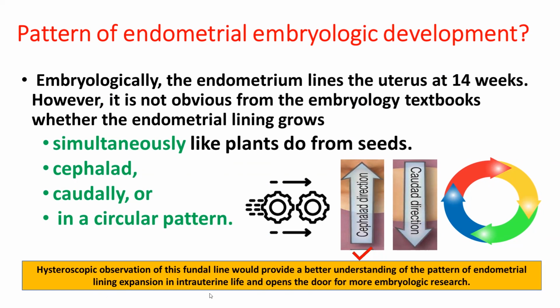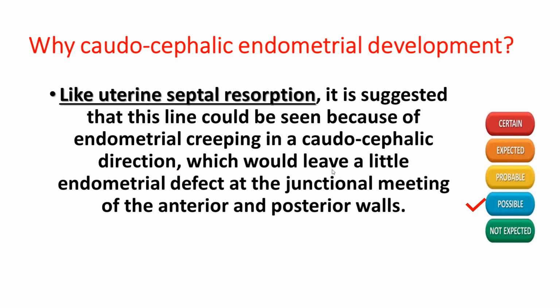So the hysteroscopic observation of this fundal line would provide a better understanding of the pattern of endometrial lining expansion in the intrauterine life, and opens the door for more embryologic research. And it is possible that the growth of the endometrium comes from the cervix to the fundus, as evidenced by these hysteroscopic observations. The question is, we don't see it in all cases.